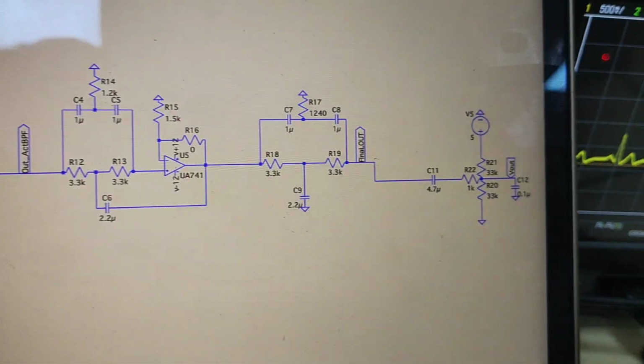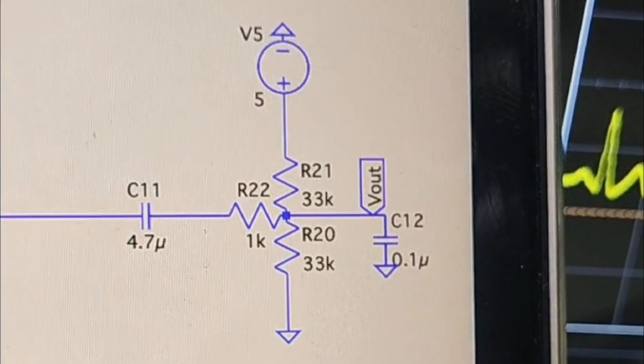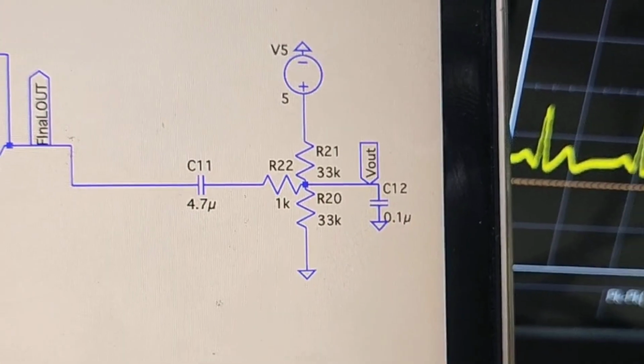The final stage of our circuit is the output buffer and level shifter. This stage serves a critical function. It limits the output voltage range to 0 to 5 volts and centers the signal at 2.5 volts. This signal conditioning is essential for interfacing with the Arduino's analog to digital converter, which requires a signal within the 0 to 5 volts range. This stage ensures our ECG signal can be properly digitized by the Arduino for heart rate calculation.